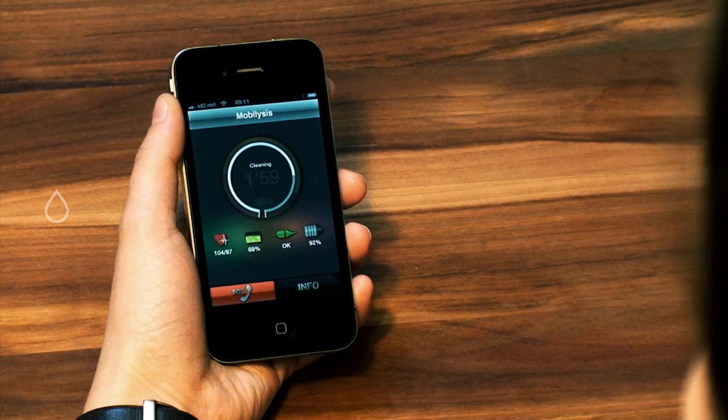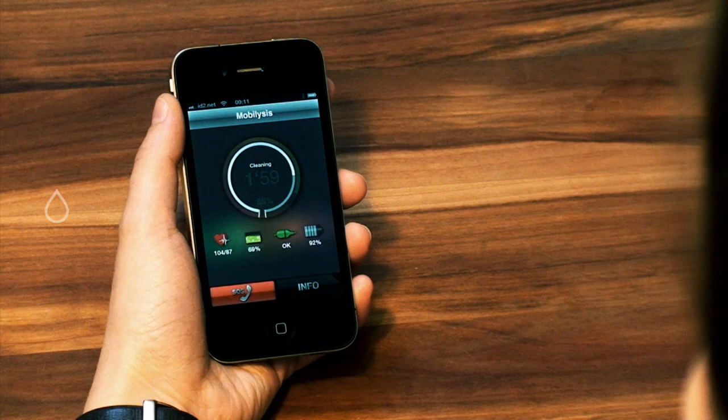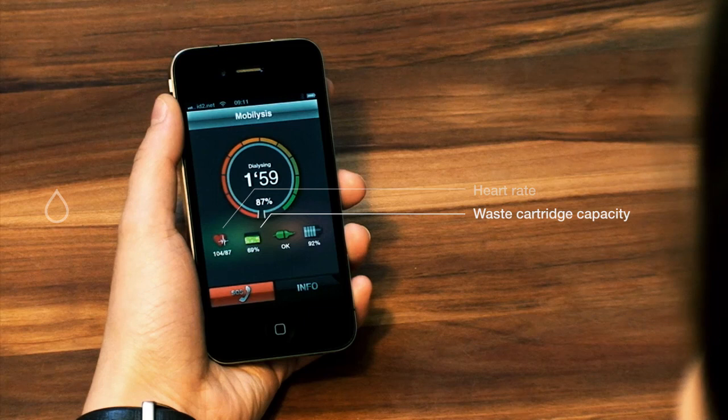The four icons below the circle indicate the patient's heart rate, remaining capacity of the waste cartridge, the connection status, and the remaining battery life.